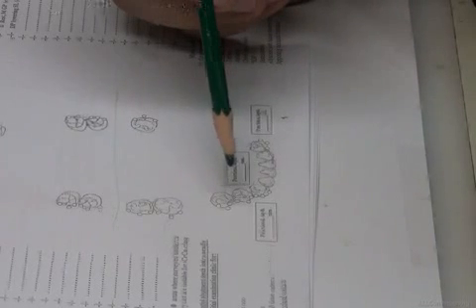The metal base with a pin in it. Okay, that's better. So, why? Because I could better produce a clearance for the marginal gingiva. So the acrylic will not be touching the tooth. I will have metal base all around, because usually with single teeth the amount of resorption is not too much and I don't need relining.